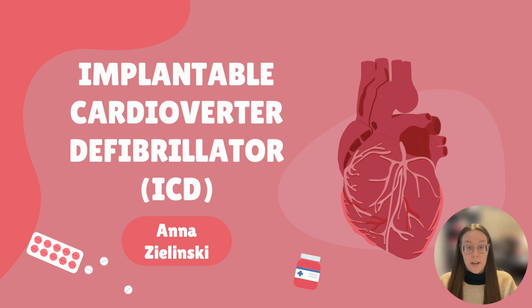Indication for the placement of an ICD is based on many factors, including pre-existing cardiac structural abnormalities, which places patients at a higher risk of experiencing a lethal rhythm. This medical technology can prevent sudden cardiac death in individuals with risk factors.